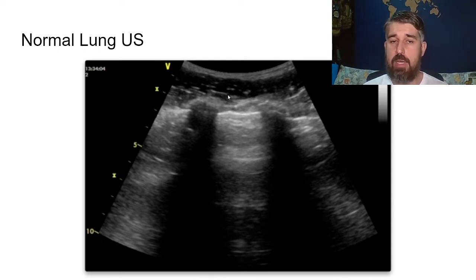If on the one hand air doesn't conduct sound very well, on the other hand, solids like bones, sound can't pass through. It just comes back to the probe. So it won't pass through the bone, and we also have shadows behind the ribs. So the probe is between two ribs. They have their shadows. Here we have the subcutaneous tissue, and this white line here is the pleura.